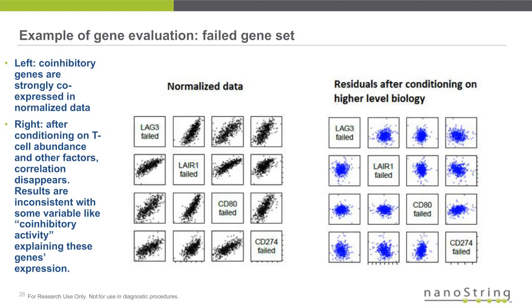They appear to be measuring the same thing. But we're not satisfied with that. We apply a few more conditions. We want to make sure that these genes are measuring what we think they're measuring and not just some other variable that happens to drive their co-expression.